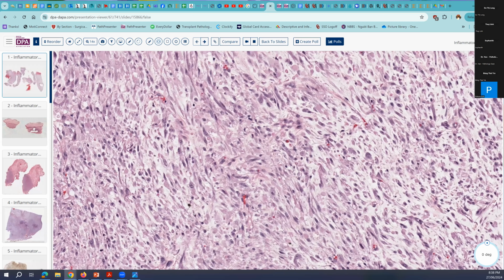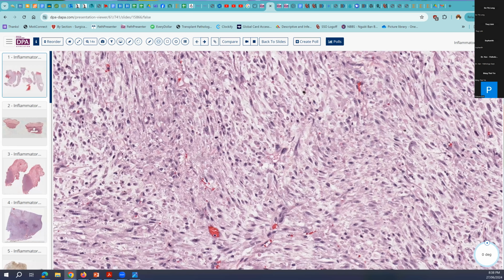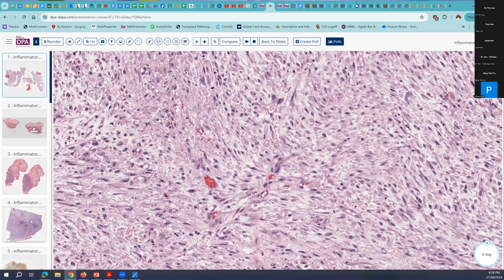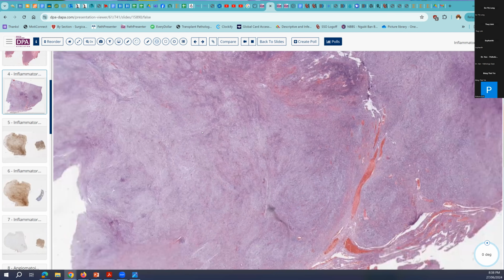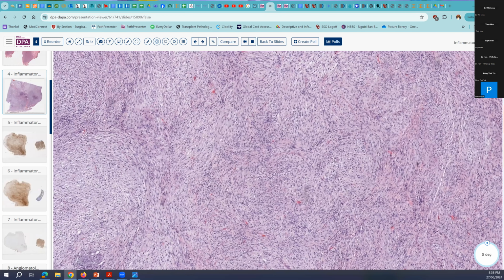So you can see why this was something I was thinking we should think about in that retroperitoneal lesion. I'll show you another case that we had from our laboratory, which you can see here. And you can see, again, this sort of spindle-shaped stroma, not very high cellularity, variable streaming and nodular pattern.